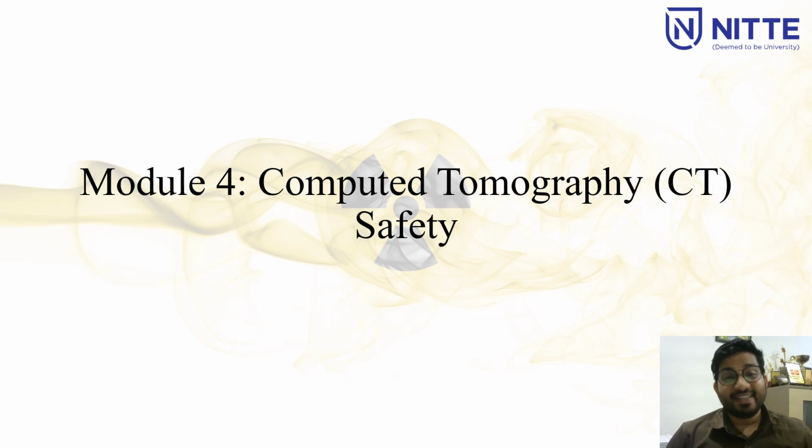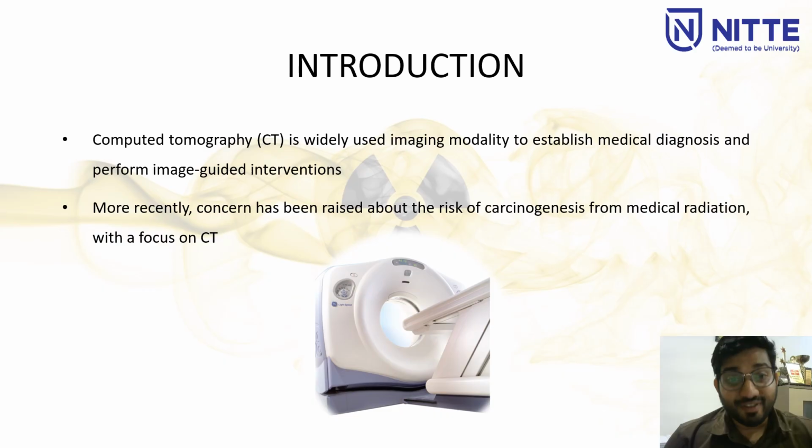In this session, we will be discussing computed tomography, safety in CT. When we look worldwide, the CT scan has been significantly increased, and the increase in the number of pediatric CT scans increases multiple CT exposure of the same patient, because if one patient gets admitted, you will do a CT for any abdominal issue, and you will do a check CT later. So repeated CT scans have significantly increased, and the number of unjustifiable CT scans too.